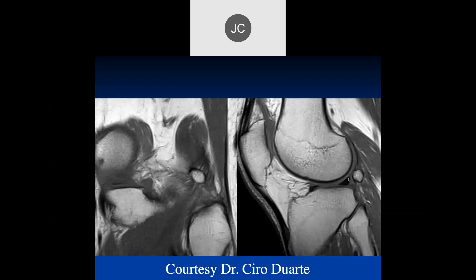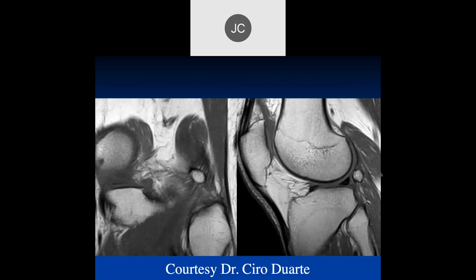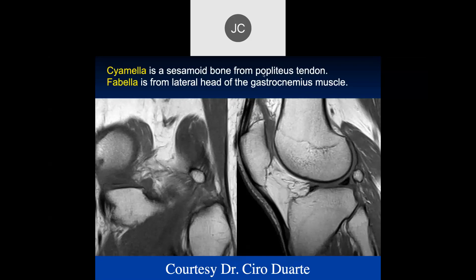On these coronal and sagittal T2 images, we have another accessory ossicle, more inferior than where we typically see the fabella. Both are on the lateral side. Looking at the fiber direction going obliquely — this is actually in the popliteus tendon, and that ossicle of the popliteus tendon is called a cyamella.